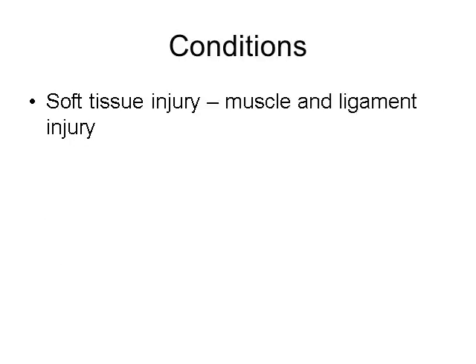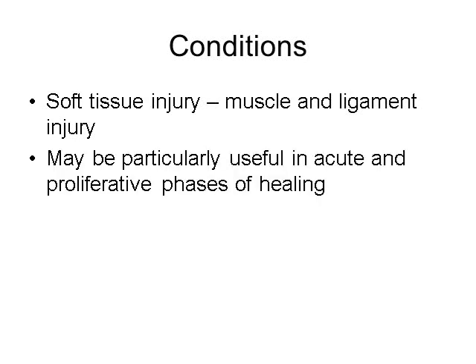Ultrasound is predominantly used to treat soft tissue injuries such as muscle and ligament injury. The basic research evidence suggests that it is most effective in the early stages of the healing process and is likely to be less beneficial in later stages. There is some interesting work ongoing to explore the effects of ultrasound on the healing of bone, with some positive findings. This is likely to be an important future focus for researchers in electrotherapy.